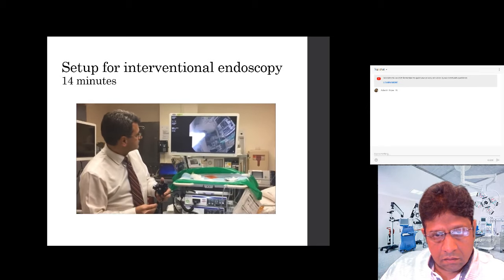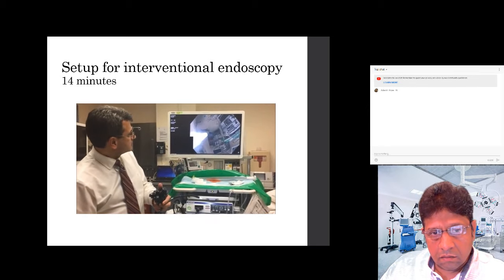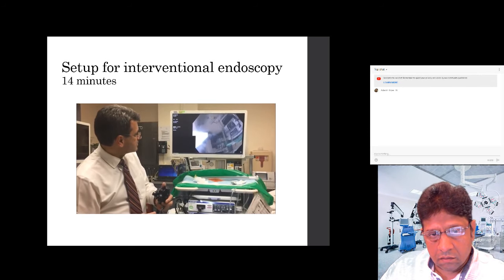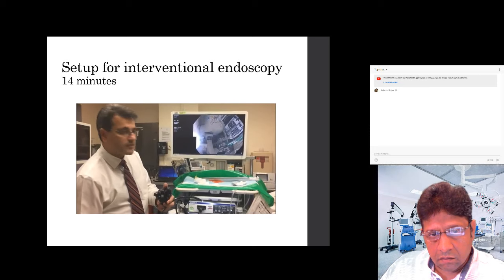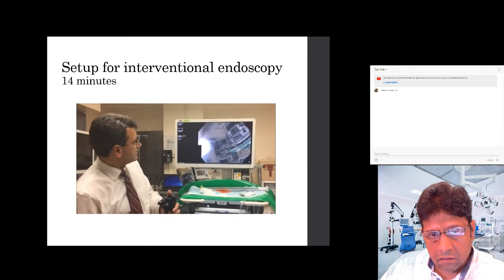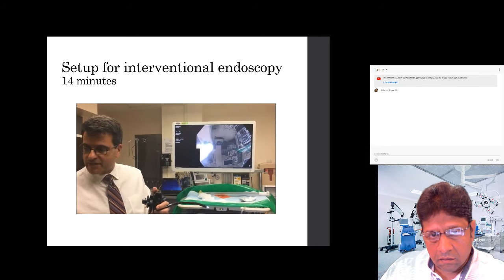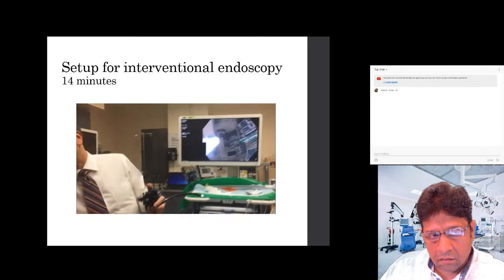Okay, so needle out. Okay, and you can see, can we see it too? Let's see. Yeah, see the needle? Let me just jiggle it so you can get that little bubble off. So you can clearly see the needle as it's coming through. And then we push it up against the vessel, and we might say inject. And then you grab the syringe, and you can come back over here just to show it the syringe.